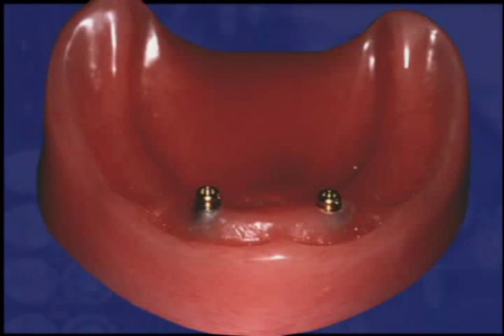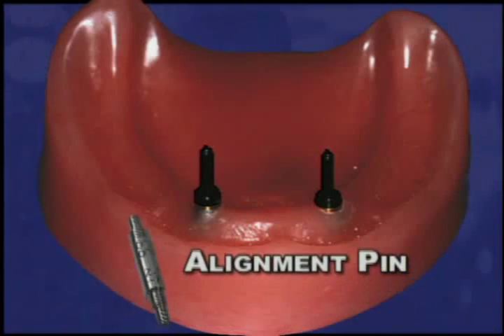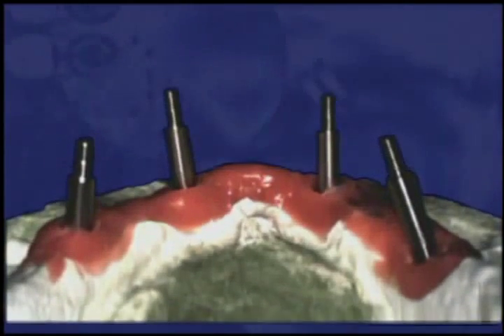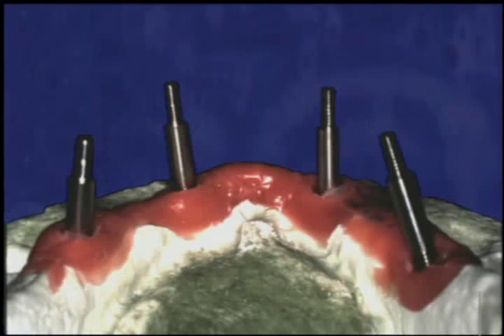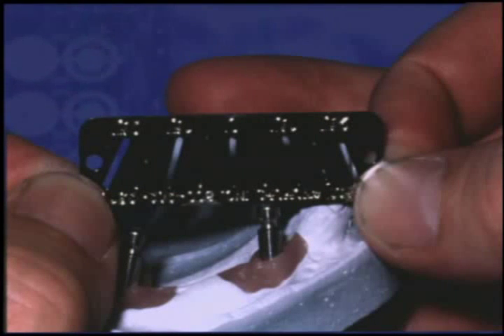The locator abutments maintain a very low profile, even on implants placed as shallow as those used in this demonstration model. Snap a locator parallel post onto each abutment to check that the implants are parallel. If the implants are not parallel, Zest Anchors provides an alignment pin and angle measurement guide to determine the degree of divergence. The alignment pin has four different thread patterns that will match most types of implants on the market. The angle measurement guide is held level with the path of prosthesis insertion to determine whether divergence will require the use of a locator white or green replacement male.